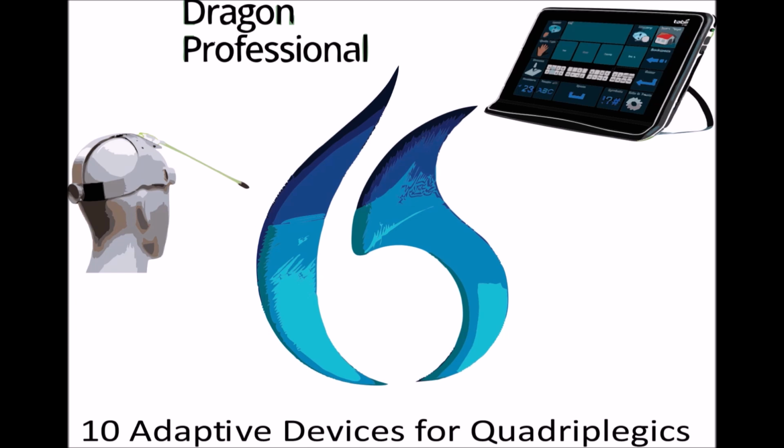There are various types of transfer aids available, depending on the individual's needs and abilities. Some common transfer aids include 1. Transfer boards. These are flat boards used to slide the individual from one surface to another, such as from a bed to a wheelchair or from a wheelchair to a car.